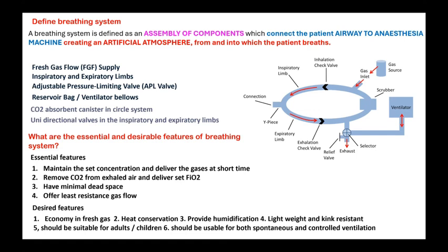volume of the patient. So, the functions of the reservoir bag are mainly: it acts to monitor the effectiveness of the patient's respiration. It provides the peak inspiratory flow for the patient, so inspired gases reach up to the alveolar level. The third point is that it also, as you said, prevents barotrauma by accumulating the gases in case there is an excess gas delivered into the circuit. And why is it elliptical?